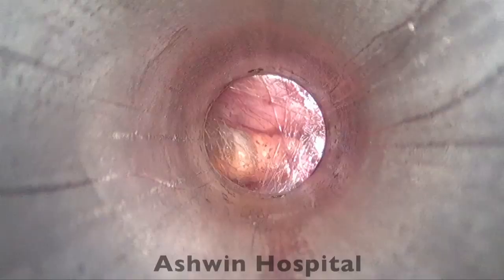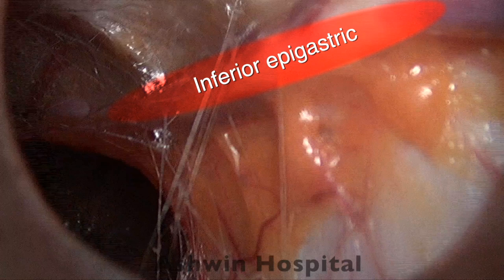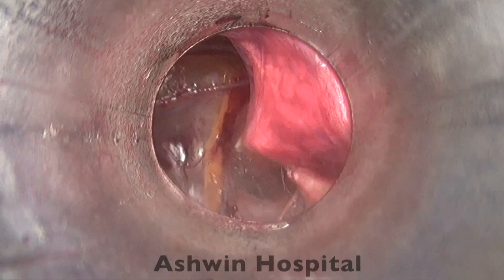So now we are just trying to see where the lateral limit of the linea semilunaris is, and we are trying to dissect the posterior rectus sheath close to that so that our working port can be made on the right side first. Like I told you, we don't use the midline ports, hence we don't attempt to dissect up to the pubis. So this is the inferior epigastric vessel running, so we have to keep that in mind. Use a needle as a marker for the direction in which we have to come in, and then we put the first working port, a 5mm trocar.